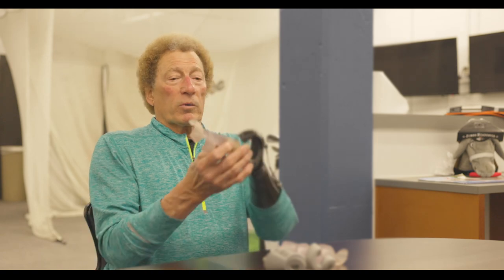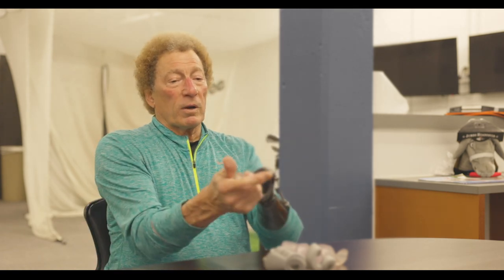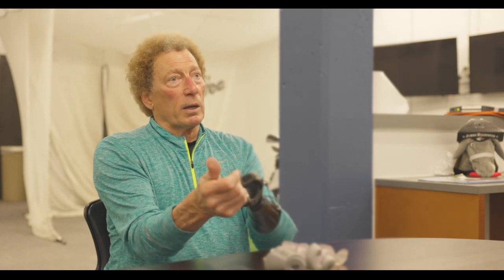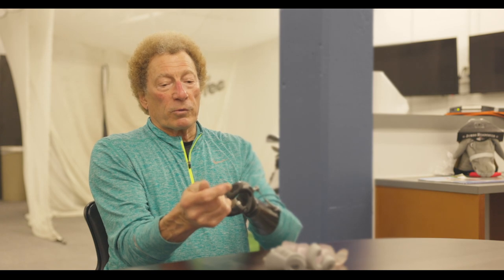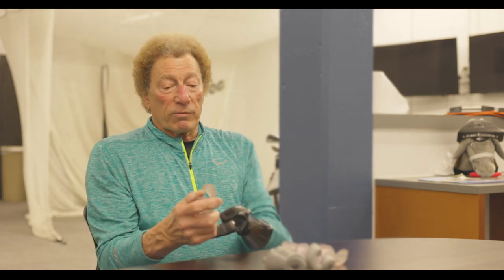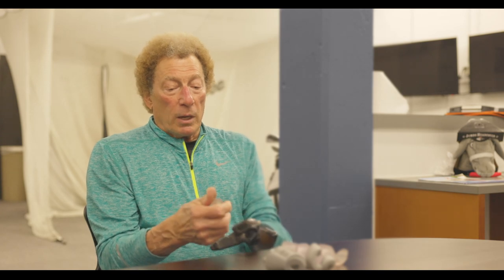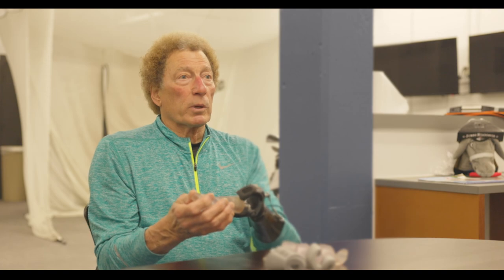It'll perform right. We've got the right angle of incidence of holding the club, the comfort level, it's not too bulky. I can get my hand around it and around the club. It feels reasonably good for getting an over grasp on, which this requires. And it's got the flexibility. It seems to be replicating the kind of biomechanical motions that I need to effectively swing a golf club.